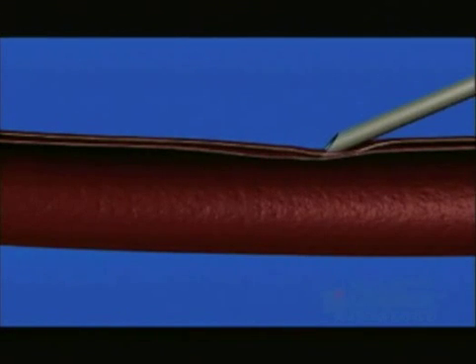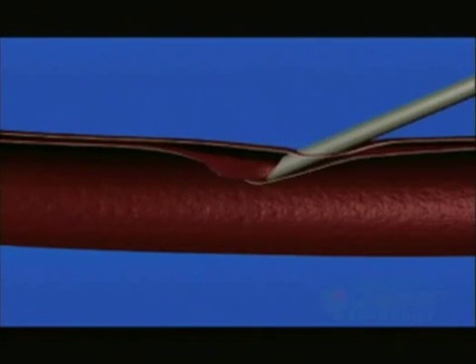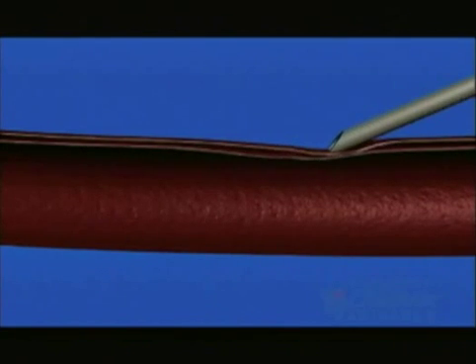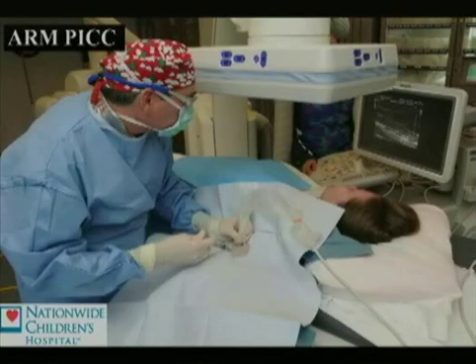One last pitfall: if we move too slowly, we can actually dissect the intima from the media and then have secondary displacement of the wire in a subintimal dissection plane that will cause complications to follow. So again, we want to move in with a brisk maneuver to avoid this pitfall.